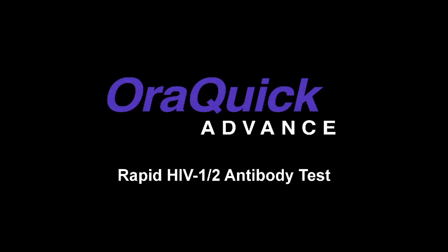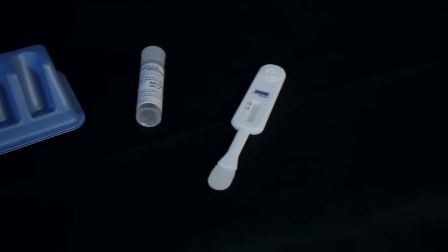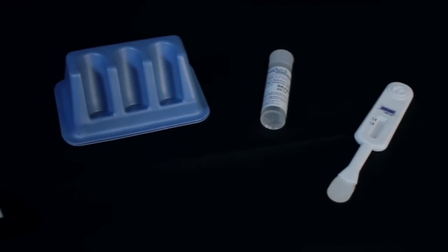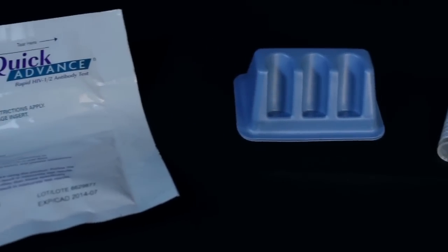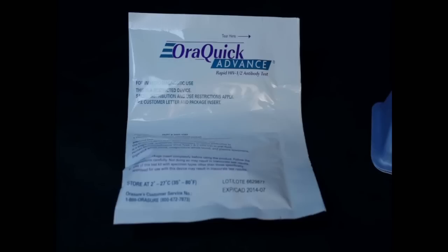Thank you for choosing the OraQuick ADVANCE Rapid HIV-1 and 2 antibody test. This video will demonstrate the proper way to use the tester for the best results. When performing this test, the steps must be followed closely. Since no test nor test kit is infallible, it is best to confirm test results by using a licensed medical testing facility.